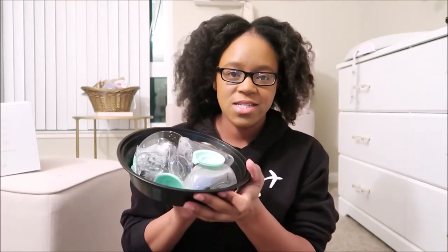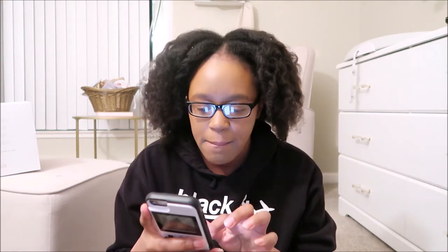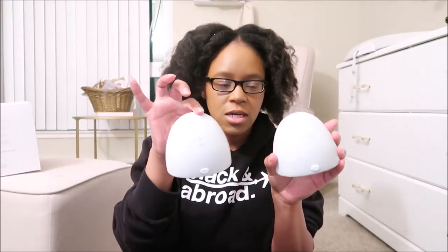I washed and sterilized all the parts. I'm gonna make sure they're nice and dry, but I wanted to share that I downloaded the app and these are both fully charged. They come with a little light on top to tell you — it's gonna be red, orange, or green. They both turned green, meaning they are ready to be used. All charged up.